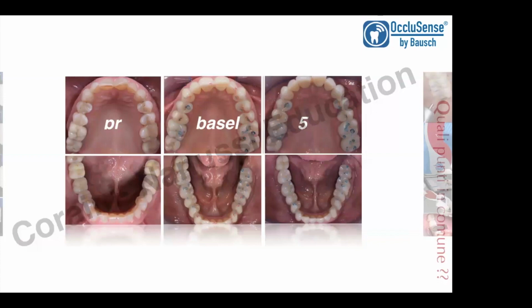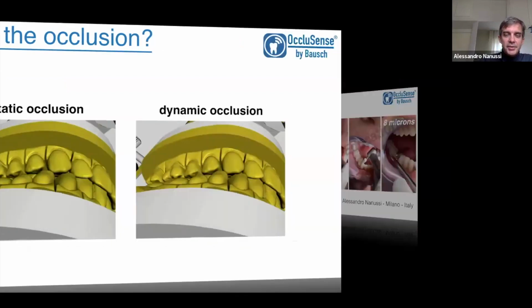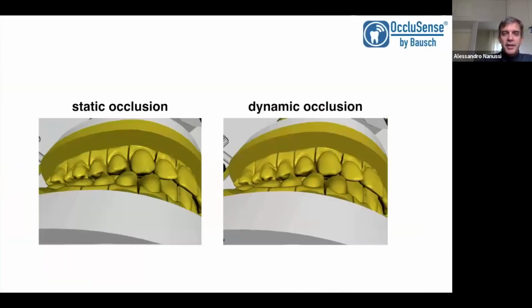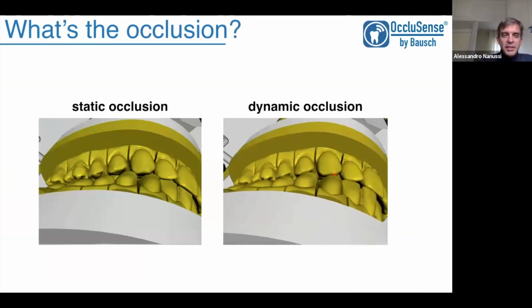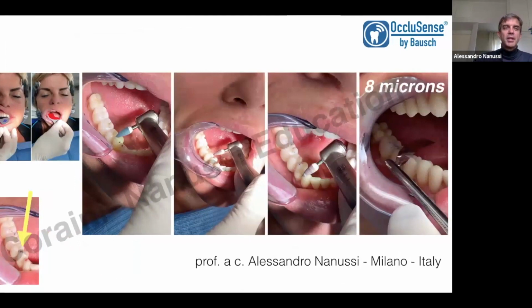It is important also to check occlusion. I want to remind you that not only static occlusion is important, also dynamic occlusion. Both are occlusion, both are function, but dynamic occlusion is sometimes more important than static. So the check of occlusion sometimes shows us some precocity of contact.